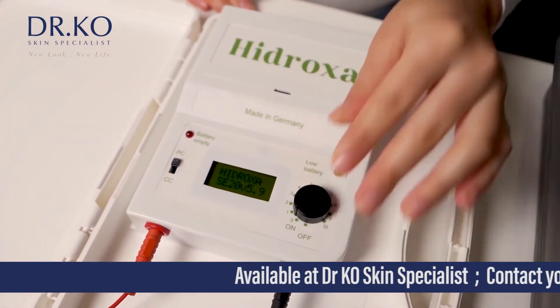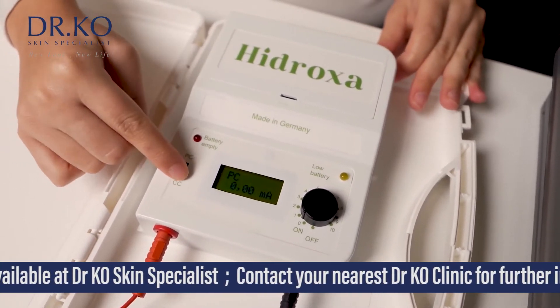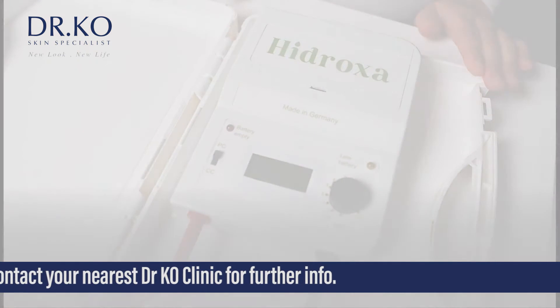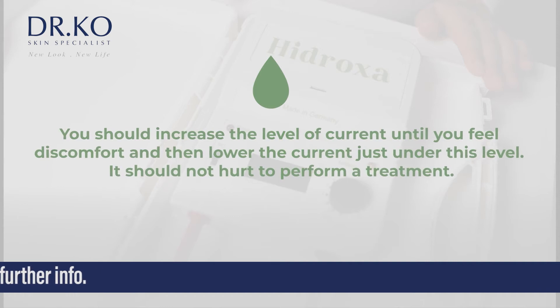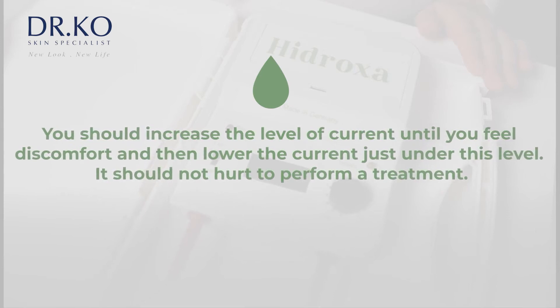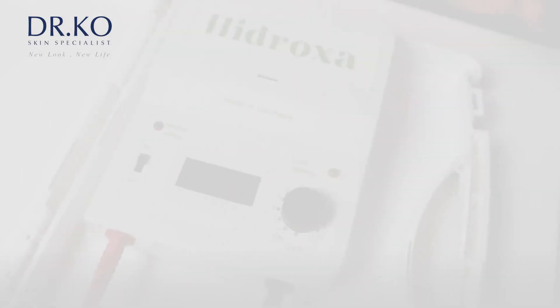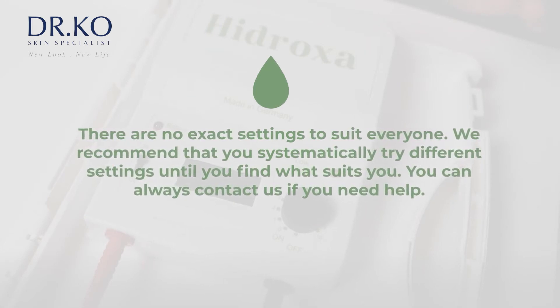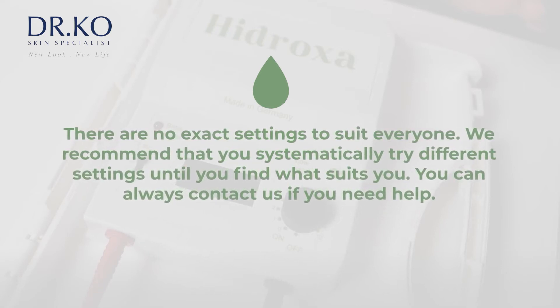When you start treatment, we recommend the use of pulsed current because it is more comfortable and you will be able to reach higher currents and achieve faster results. Adjust the current — you should increase the level of current until you feel discomfort and then lower the current just under this level. It should not hurt to perform a treatment. There are no exact settings to suit everyone; we recommend that you systematically try different settings until you find what suits you. You can always contact us if you need help.